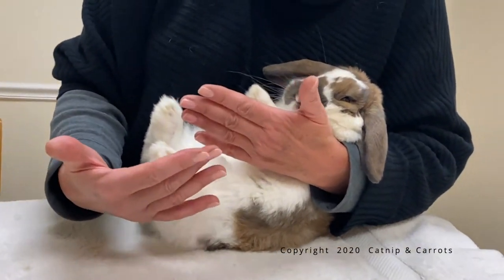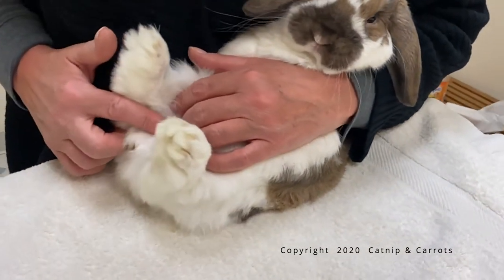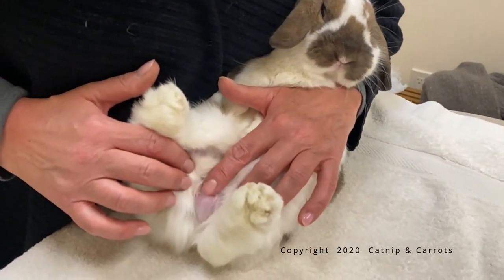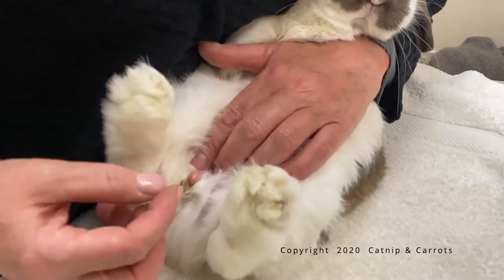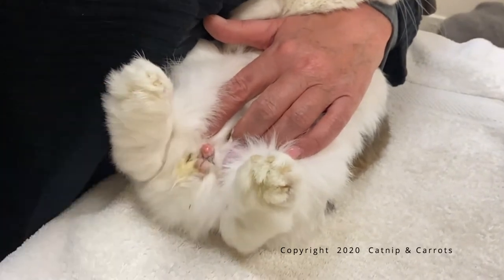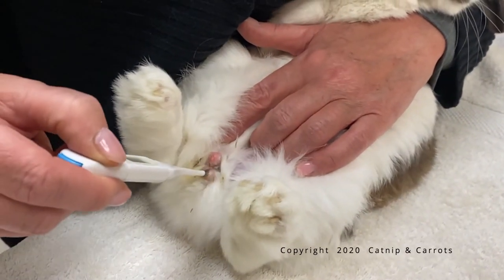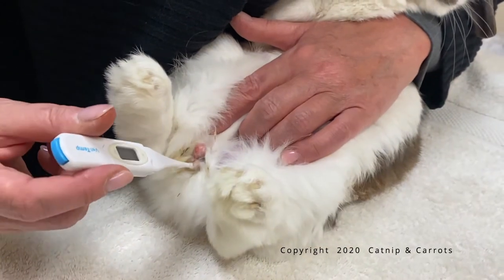Now I'm essentially balancing him with my left wrist. With my left fingers, I find his parts. Just as we saw before, these are his unneutered scrotal sacs. His penis is here and his rectum — that slit the doctor mentioned — is right behind the penis. So at a 45-degree angle, I spackle the lube onto his rectum and the thermometer goes in about a half an inch.